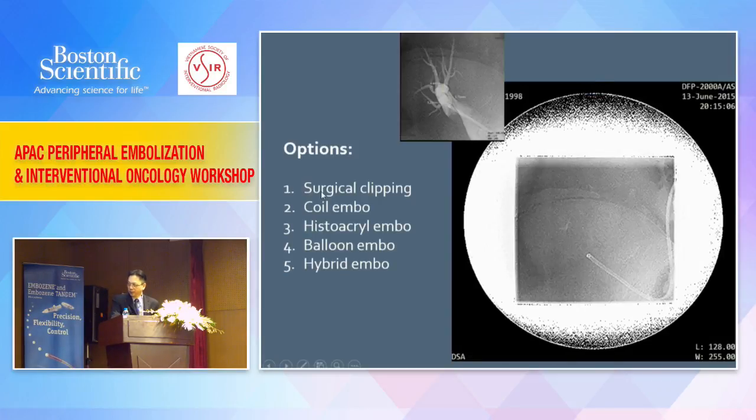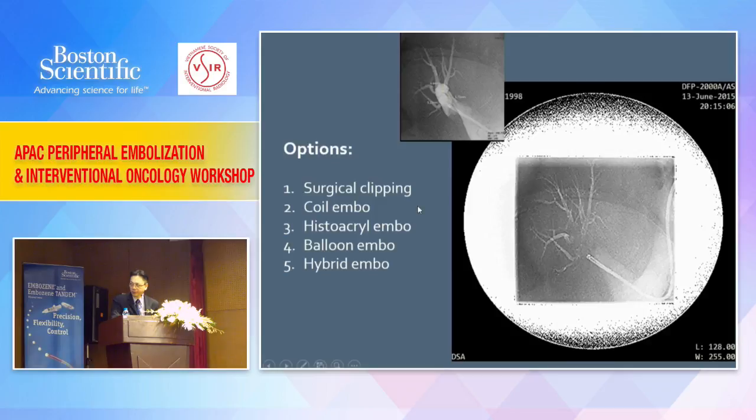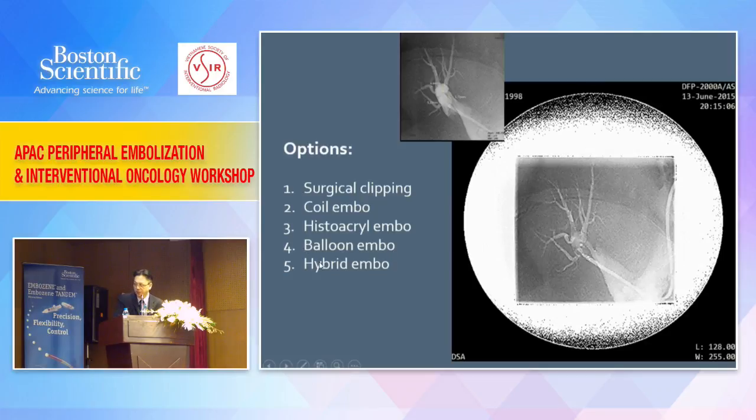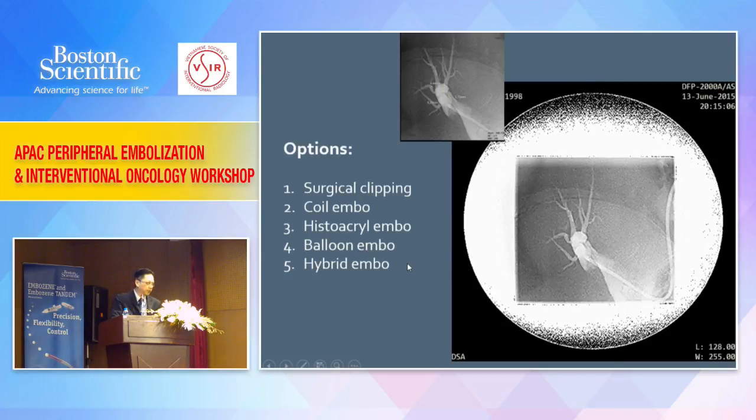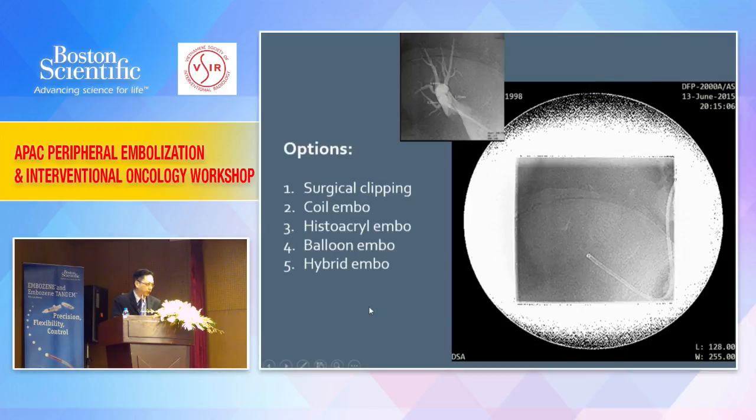Of course, in this situation, you should discuss with the family before the procedure whether to surgically clip it, which is impossible for the surgeon to reach. Whether you do coil embolization, histoacryl embolization, or balloon embolization, detachable balloon for instance, or hybrid embolization.